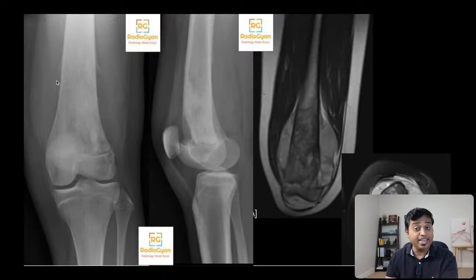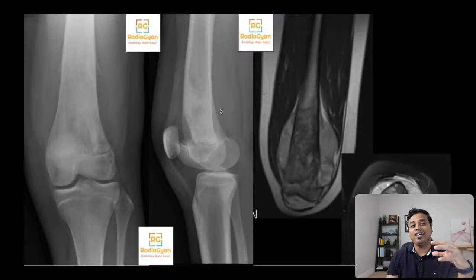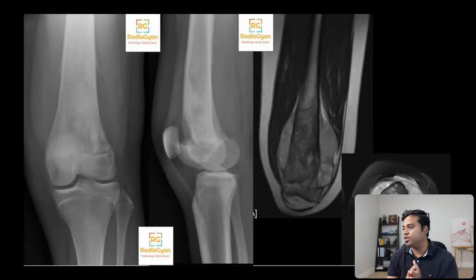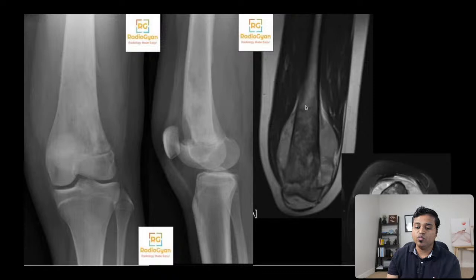There's periosteal reaction on the medial aspect as well — subtle but seen on radiographs. But look at the MR — look how little we see on radiographs. This patient has bilateral periosteal reaction in the form of Codman's triangle. There's an aggressive osteoid lesion. The final diagnosis is osteogenic sarcoma — infection would not have this kind of florid periosteal reaction.